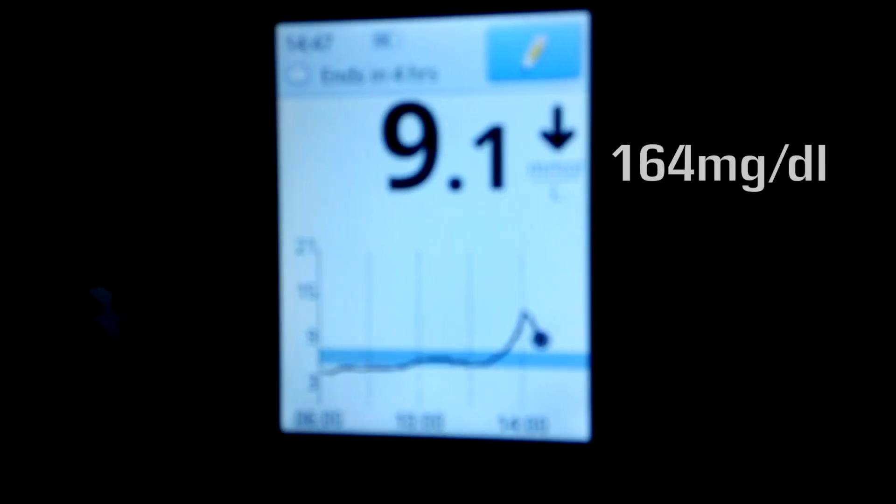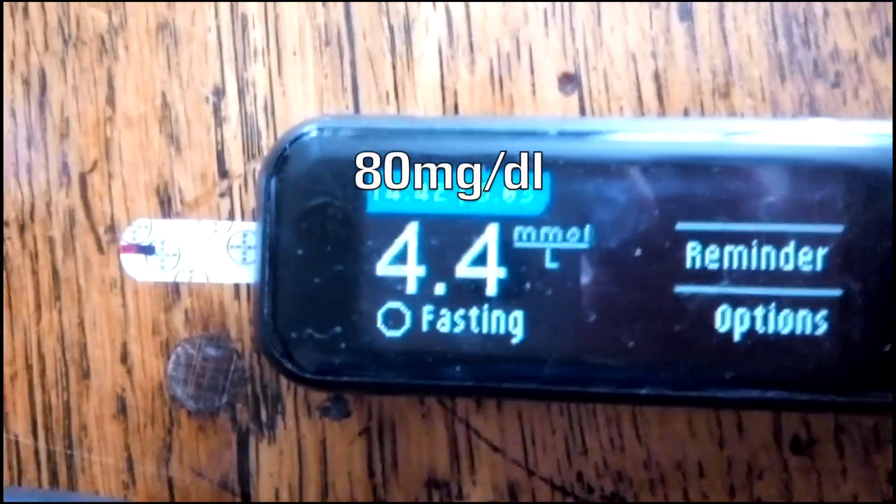According to the Libre, I'm at 9.1 with a direct downward arrow. I just did a blood test and it came back at 4.4 — so at the very bottom of the range that we should be at.